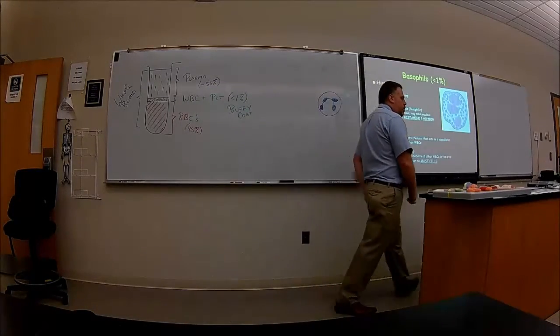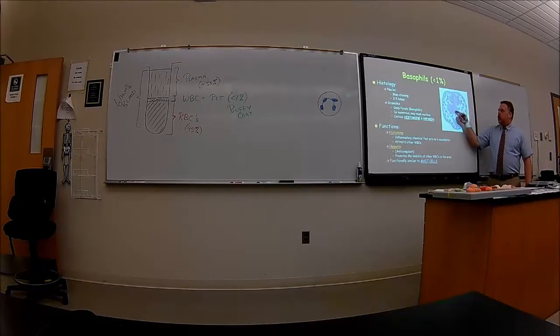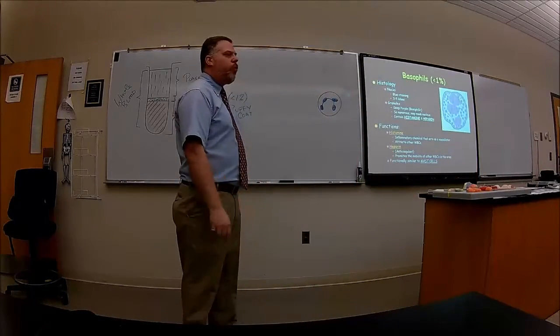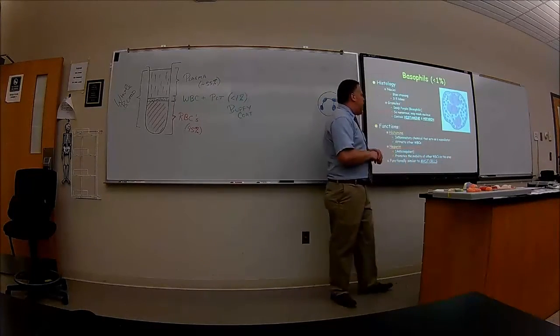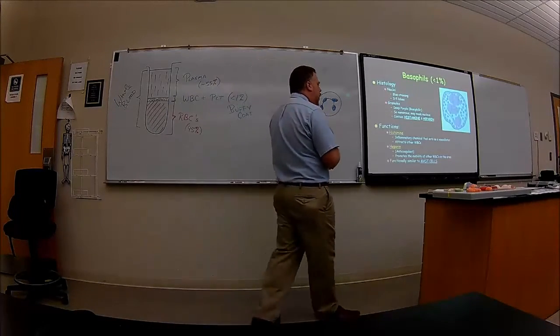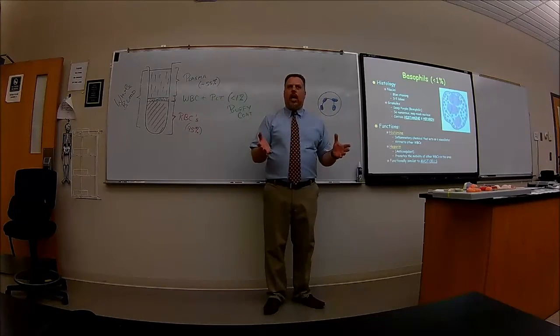The basophil. Good luck trying to find one of these suckers. Very difficult. Its nucleus is lobed, but its granules are very, very dark. So dark that it's difficult to find the delineation of the nucleus itself. The granules in here contain chemicals called histamine and heparin. Heparin is an anticoagulant. It's going to not form a lot of clotting.